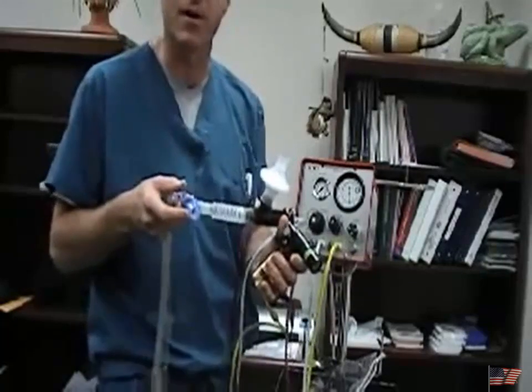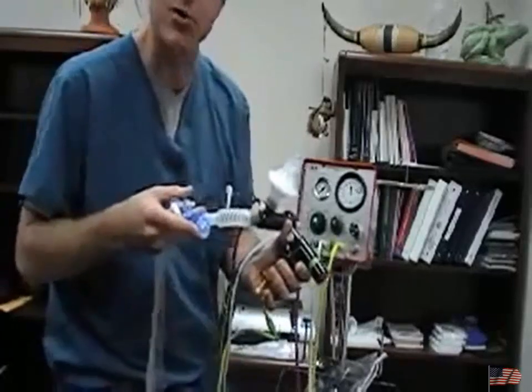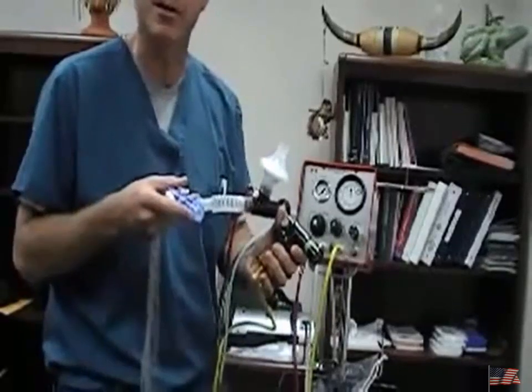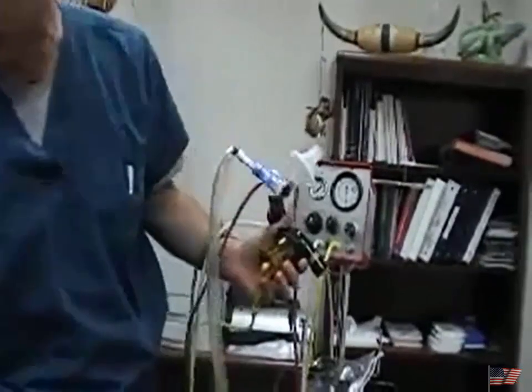When I deflate the cuff, I increase the avenue for mobilization, though, right? Because one of the main indications for this IPV treatment is if we can't mobilize secretions properly, okay? The other good indication is it is a nice recruitment tool for the lung, too, all right? So any condition that gives you either of those two items would be a good use, all right?